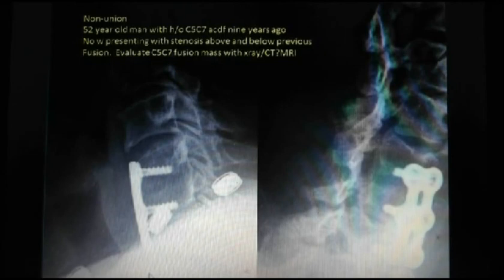In the lateral, it looks like he's fused. That looks fused, right? This view? The level, you're talking about the lower level? Yeah, both. There's two levels. Fused? You can see a little bit more on the oblique. You see disc space on the upper level. I can't see anything on the upper level. You guys can't tell.